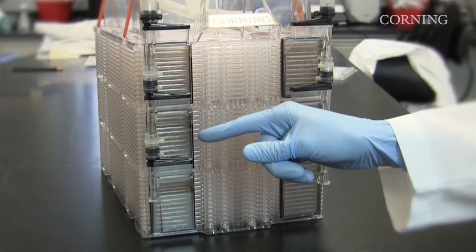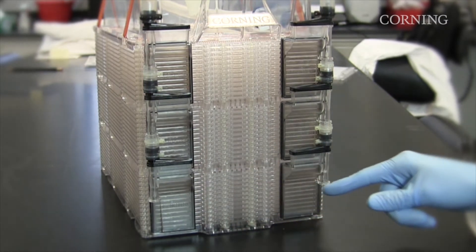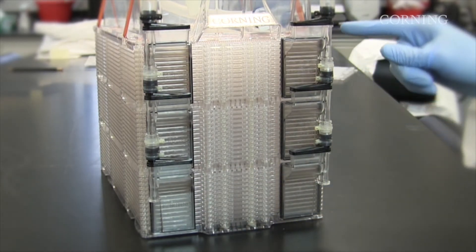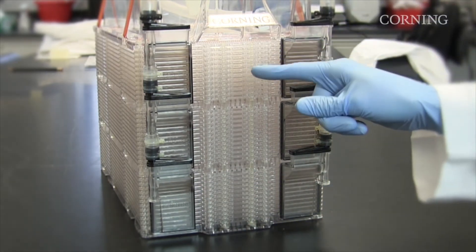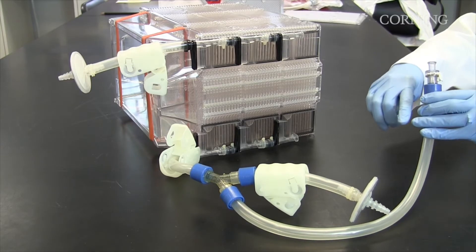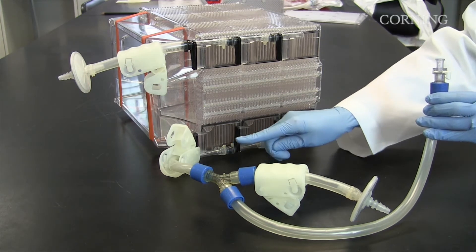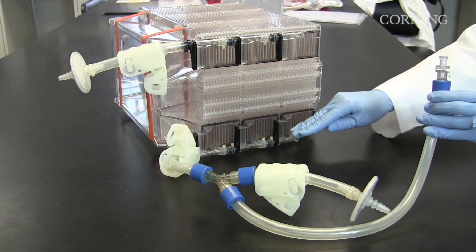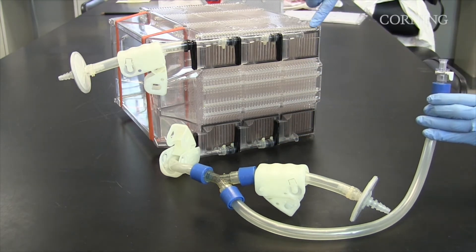The stackettes are connected by two manifolds to form a module. The HyperStack 36 vessel has three modules with 12 stackettes in each module. Liquid moves in and out of the vessel through the liquid manifold. Air moves in and out of the vessel through the air manifold.